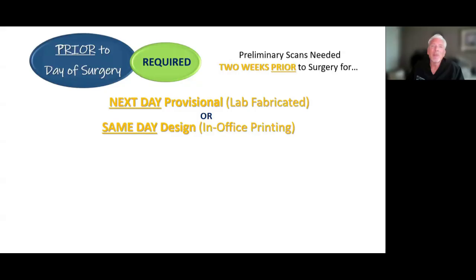So the key here, when you're going to get into same day delivery of a provisional, and when I say same day, I mean the same day of surgery, whether you're delivering a provisional that day or you're going to have a provisional the next day. So when it comes to digital workflow, you can have a next day provisional or you can have a same day design. I'll make sure you're seeing that word design there. And I'm going to explain all this to you.